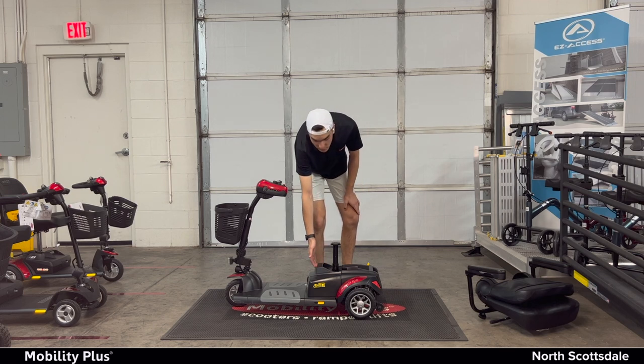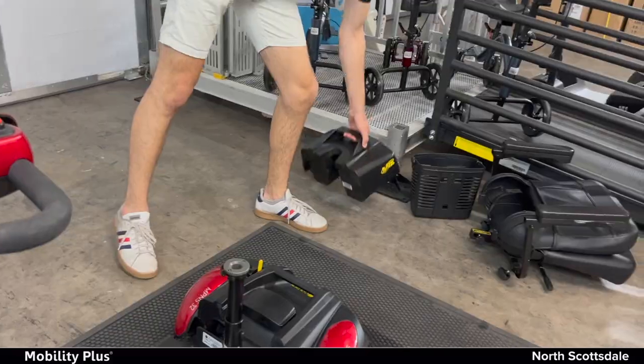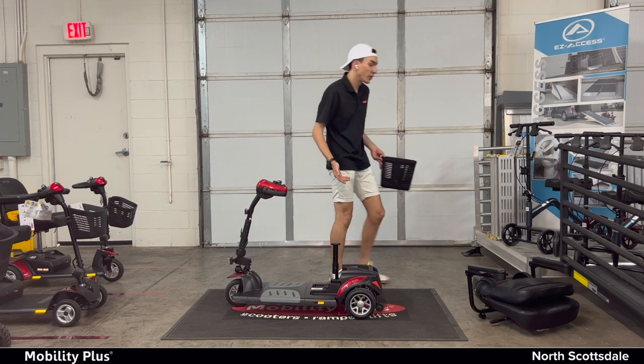Second, battery. There's a handle right here — simply lift it up and out. You can also take off the basket if you need to, to make it easier to fit in your car.